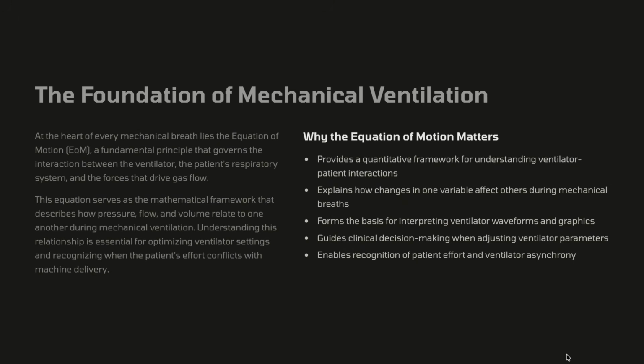We need to know this because it provides a quantitative framework for understanding the ventilator patient interaction. It explains how changing one variable affects the others during mechanical breaths, and it forms the basis for interpreting ventilator waveforms and graphics and guides the clinical decision making while adjusting the ventilator parameters. It enables the recognition of the patient's effort and the asynchrony.